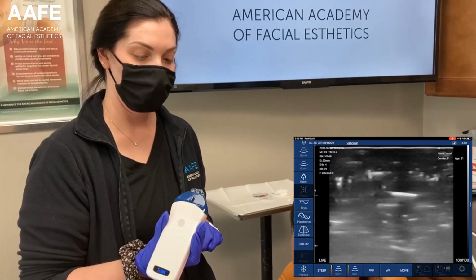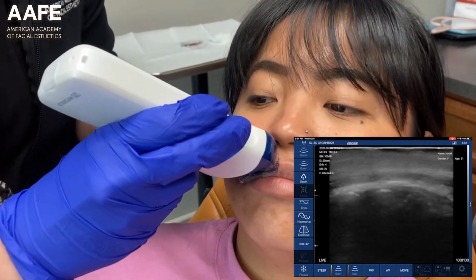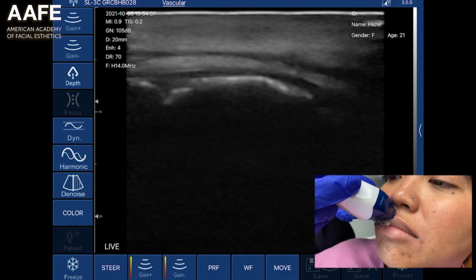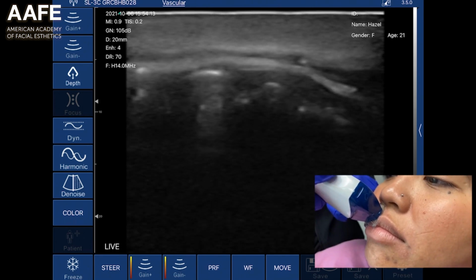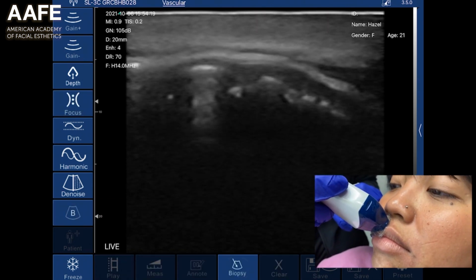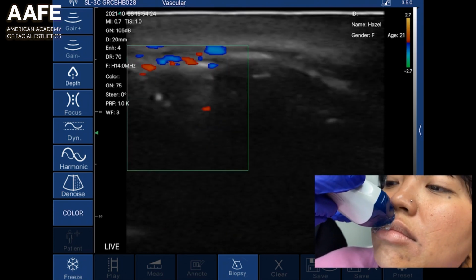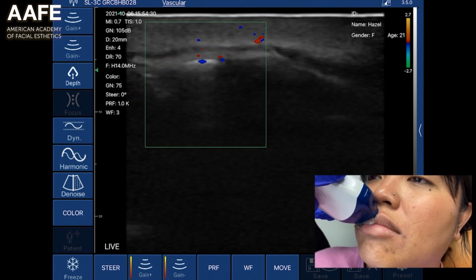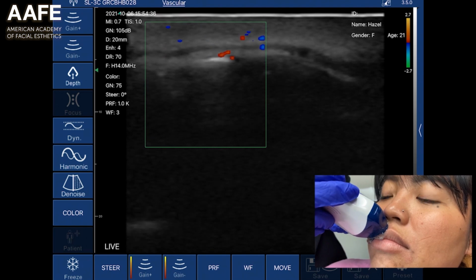Okay, we are going to go ahead and do a little examination on Hazel's lip right before we do a lip enhancement here. And what we're looking for is anything, and you can see on the big screen, we are looking for anything that may look like an artery. Just hold it in one place right there, because here we're going to turn on the colored Doppler. And let's just go back to the B mode, and now let's go ahead. All the white structures you see are going to be teeth, and now we are going to go ahead and look for the superior labial artery here, and just hold still, Lauren, with that, and that's going to look pretty good. And you can see some of that, and that looks fairly deep.